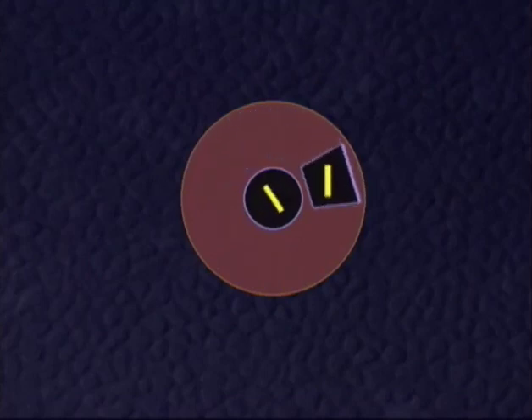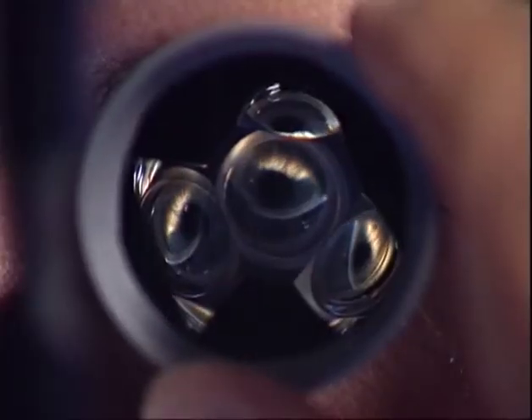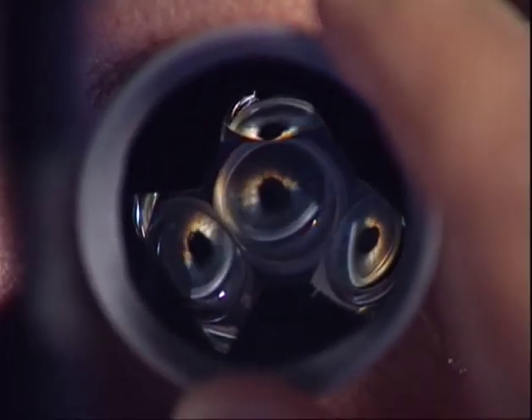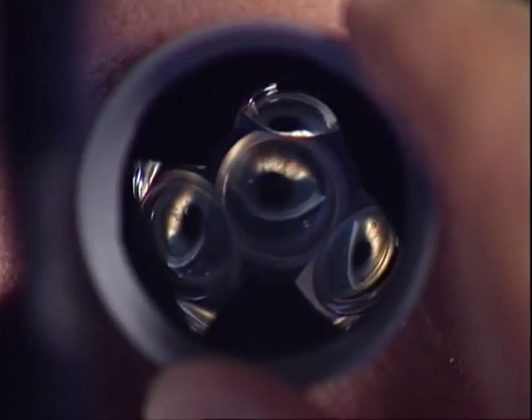Consequently, while the contact glass is rotated, the vertical slit is involuntarily rotated. Note, the obliquity of the mirrored slit is recognizable in the center of the contact glass as well. Therefore, by observing how the slit appears at the center of the contact glass from the outside, the examiner can deduce how the slit will appear at the fundus periphery.